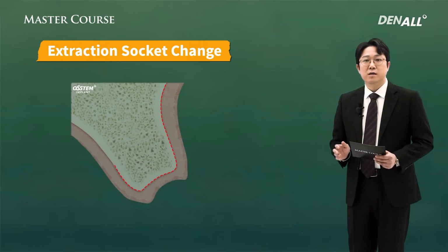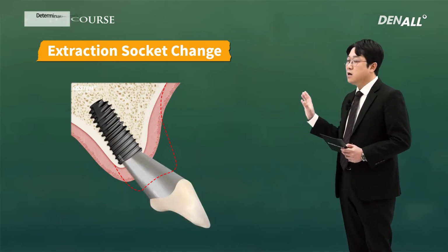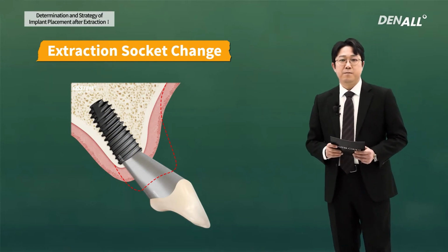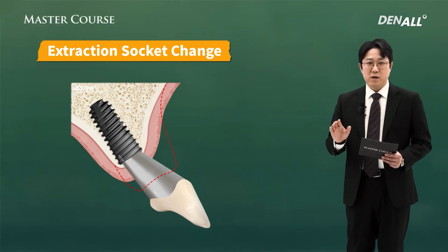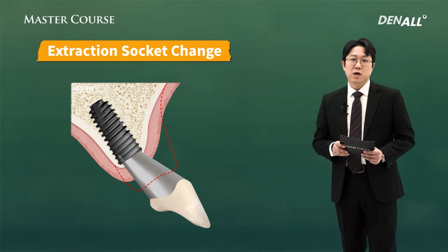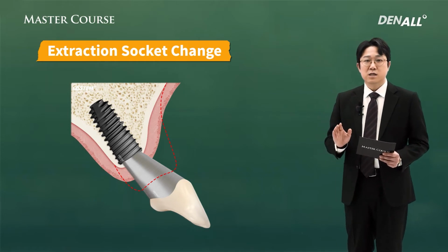Alveolar bone loss after extraction leads to an unfavorable position of the implant, and aesthetically as well as biomechanically, the prosthesis is positioned unfavorably. Due to these reasons, if you just wait after extraction is done, then the treatment period will become elongated and the alveolar bone can be very severely resorbed. In order to solve these issues, immediate implantation was proposed.